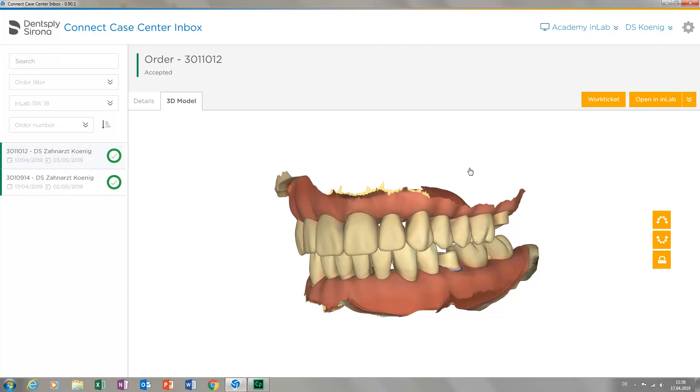Since during the initial setup we enabled the script Open in InLab, we can then open the current case with the InLab software. Alternatively, cases can be opened with the ExoCAD software version 2.3 or higher, provided ExoCAD is installed. This requires that the script Open in ExoCAD is activated.